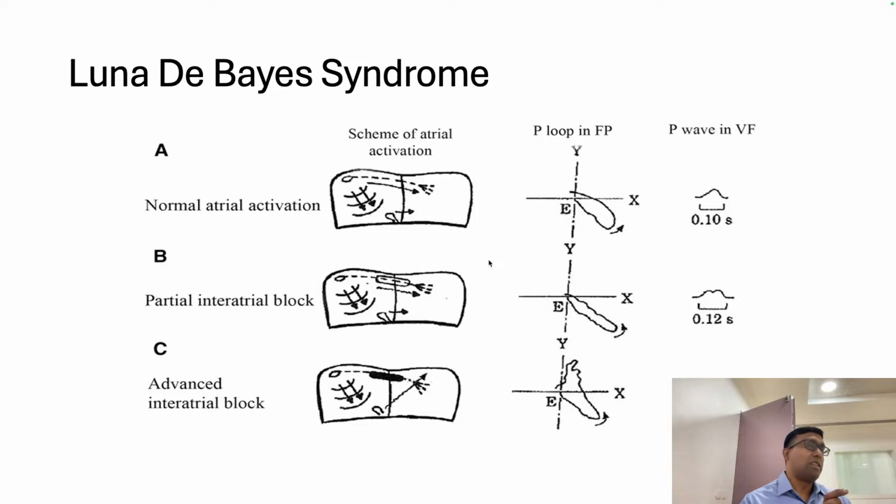It is the same thing. These patients will develop atrial fibrillation. So by seeing the ECG, you can say the patient has had atrial fibrillation in the past. That is the importance of seeing the ECG and the electrical axis. What you are seeing here is that P wave duration has increased, meaning the conduction time is taking more. The atrium is diseased, so the patient can be having atrial tachycardia, atrial fibrillation as one of them. Without seeing the ECG, you are anticipating. So take the patient to the cath lab and you will get atrial fibrillation in that patient. Usually this has been described in elderly patients. And in 2012, this paper came out.